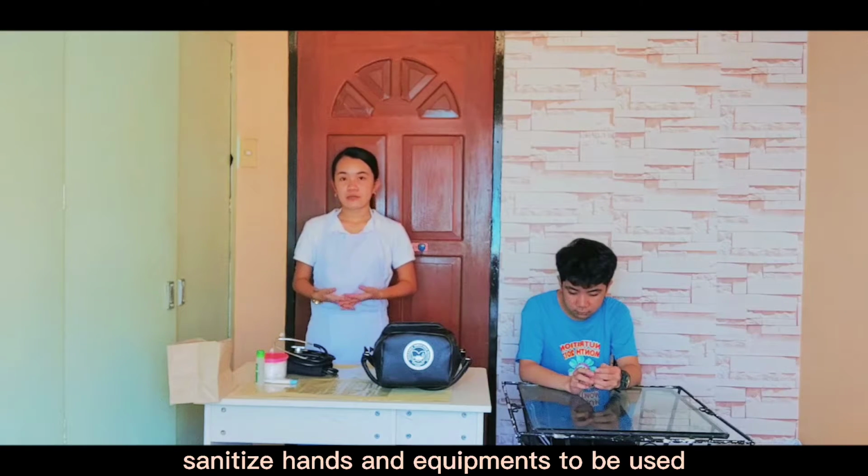So what I'm going to perform today is taking the vital signs of the client. The first thing I need to do is to sanitize my hands and the equipment that will be used.